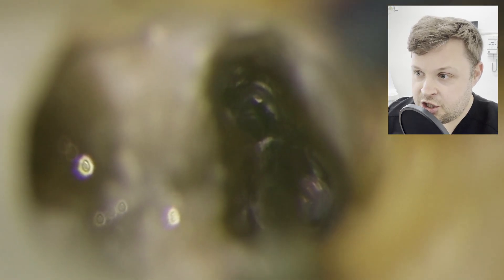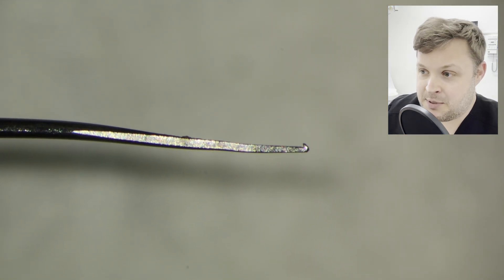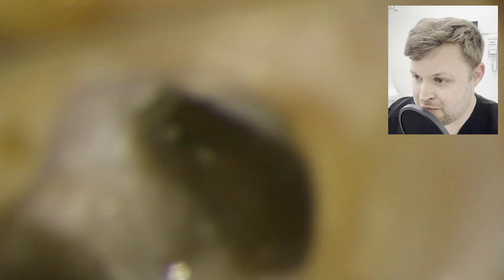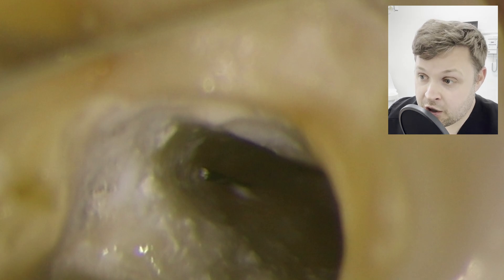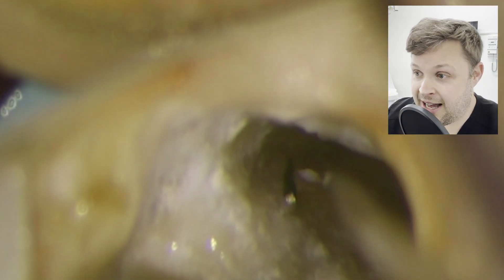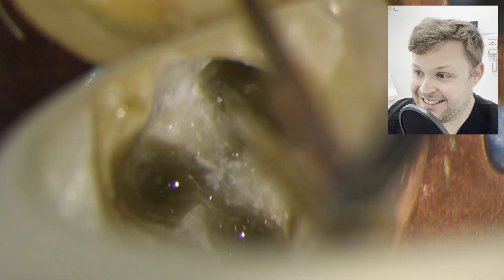Activation usually pushes the file out of the canal. I'm getting the activating tip at the base of the file to push it out. I use this GP remover all the time — it's absolutely fantastic for removing GP — and in this case the file is very, very loose, so I can probably just hook it out with the GP remover. I'm just slowly, slowly moving this file. What you really must do is block the other canal spaces, because you'll pull the file out and it can just drop into the other canals — a really difficult conversation to have with a patient.